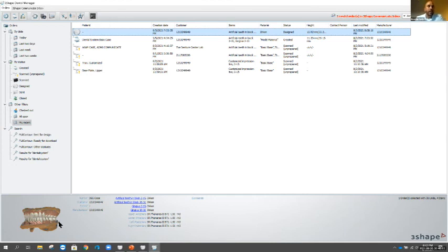Milling is significantly more expensive than both, but it is a lot stronger than both. It's stronger than traditional just because you don't have to worry about porosity in the dentures. So it's a solid material through and through, and it's typically still an acrylic. It's just a milled acrylic instead of a processed acrylic.